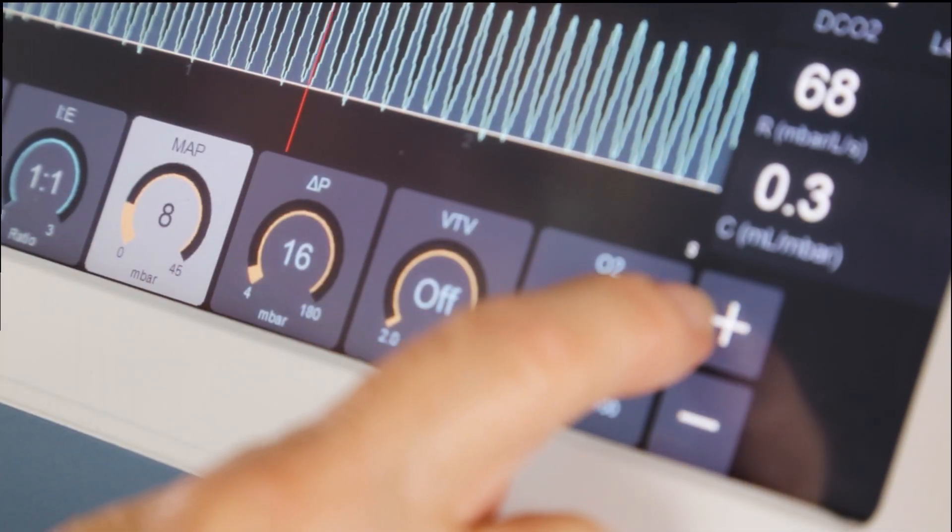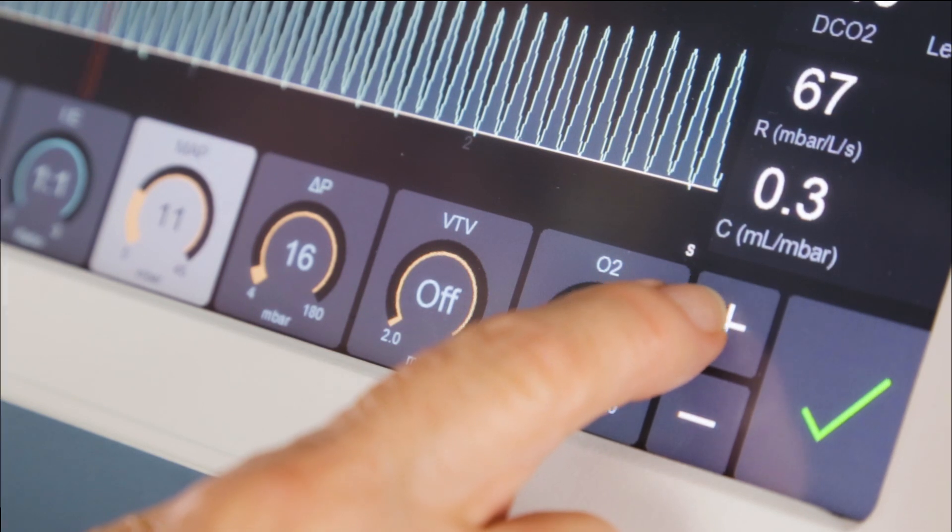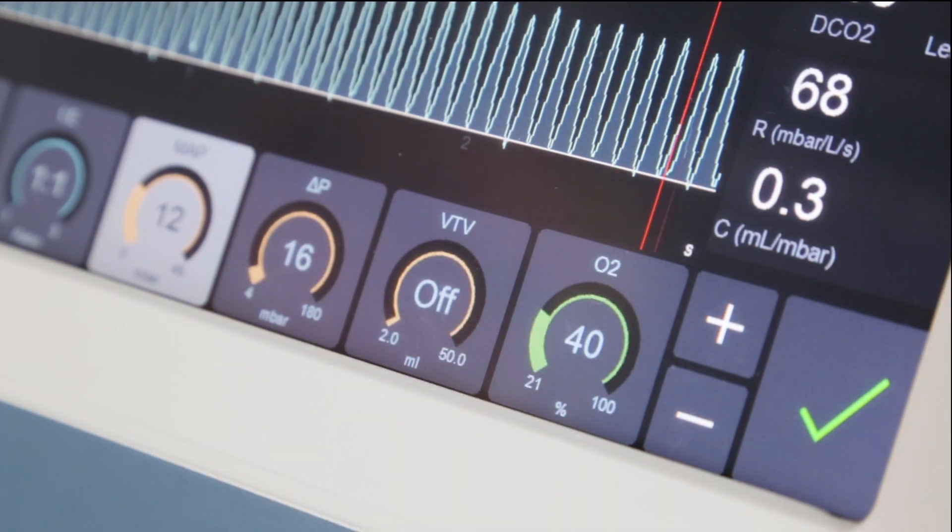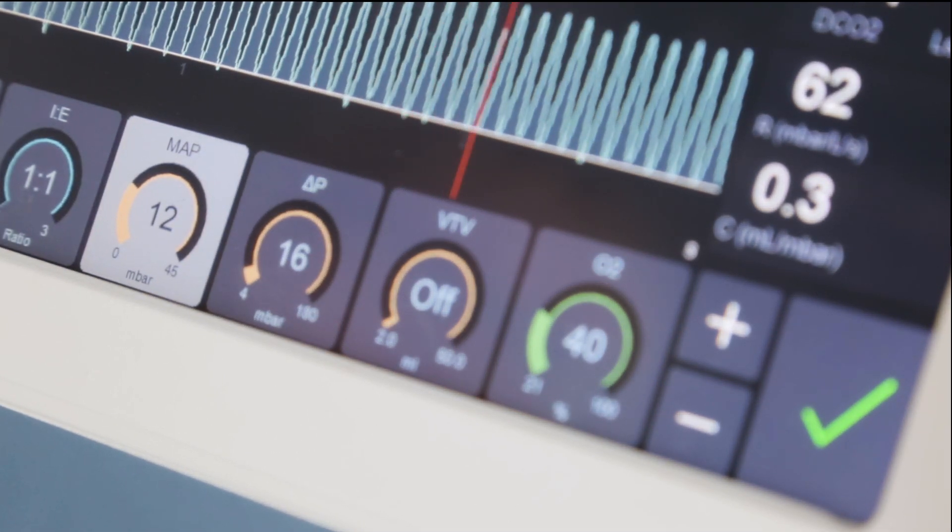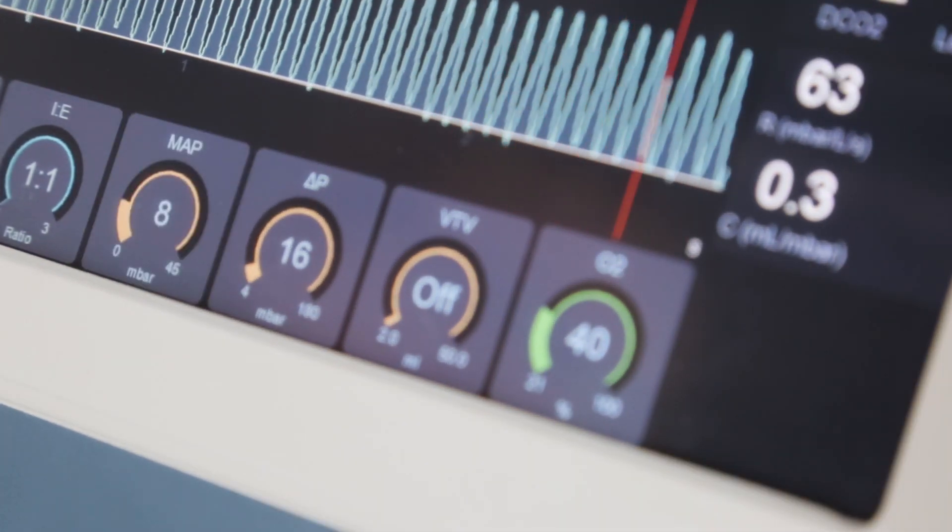Pressing any button activates it and changes its colour to light grey. Most buttons have a time-out function, meaning that if they are selected and not confirmed within a number of seconds, they will automatically deselect themselves.